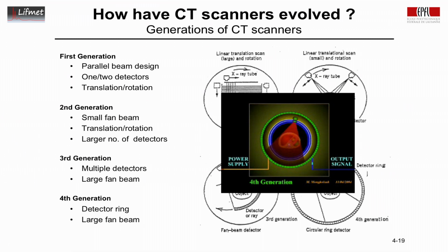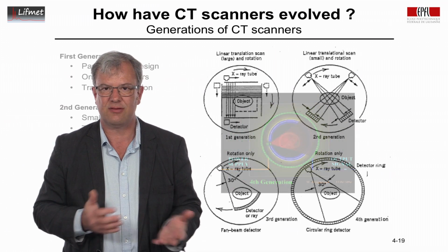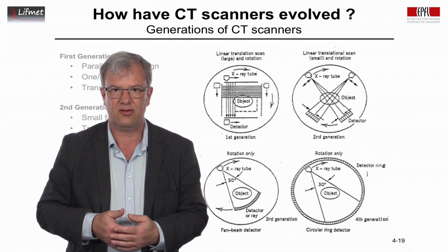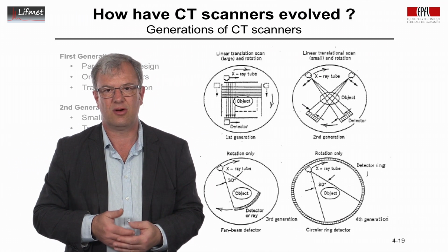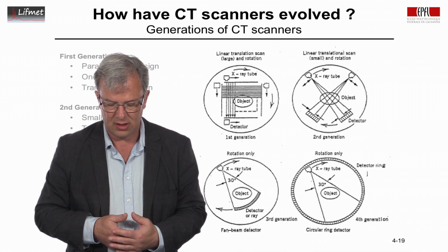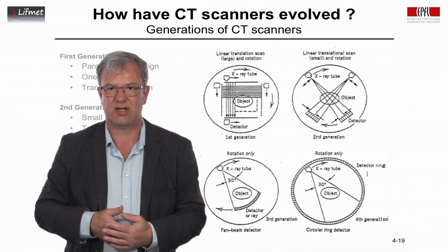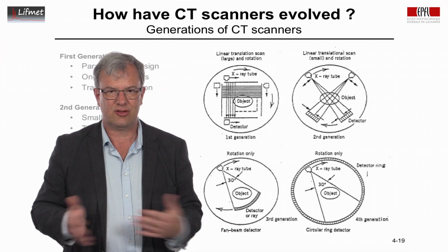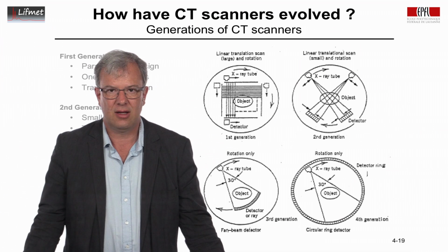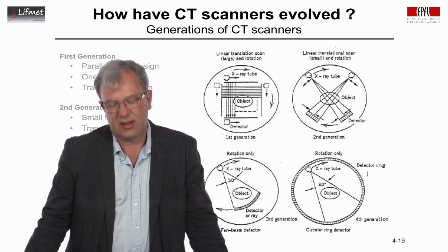computing power. As to the cost of a CT scanner, it depends of course on the country, depends on the currency, but of the techniques we're discussing in this course, it is the cheapest technique aside from ultrasound. It's a few $100,000. Take it euro, dollar or Swiss franc, it's roughly the same thing. It's on the order of 100,000 to 200,000 Swiss franc.